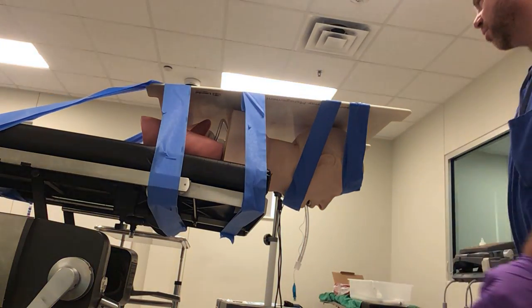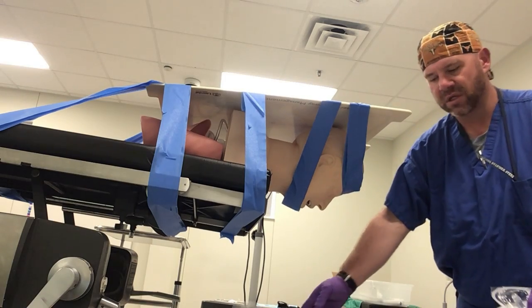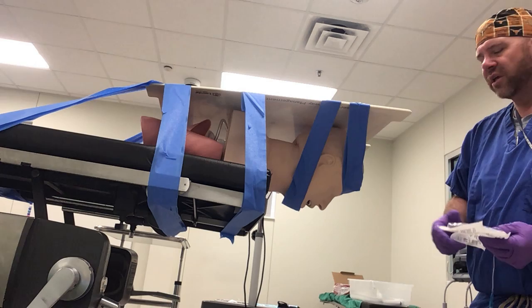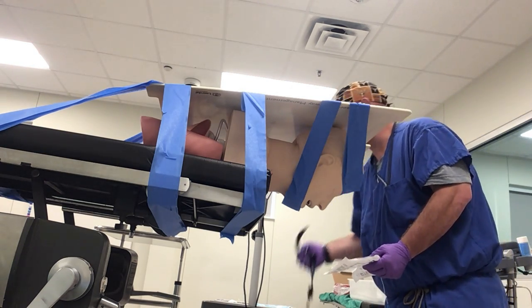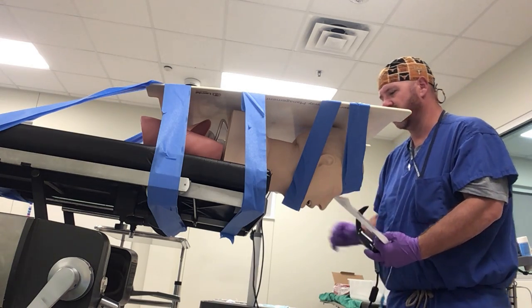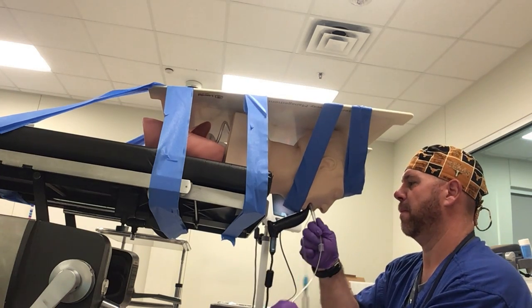So you have a patient in the prone position for surgery. For whatever reason, your airway is lost. Obviously an emergency in the operating room that needs to be recovered from pretty quickly. You can ventilate a patient in the prone position, but it's very difficult. So, techniques to get that tube in place as fast as possible, as I mentioned: you can use a video laryngoscope, or you can also use an LMA and then intubate through that scope.